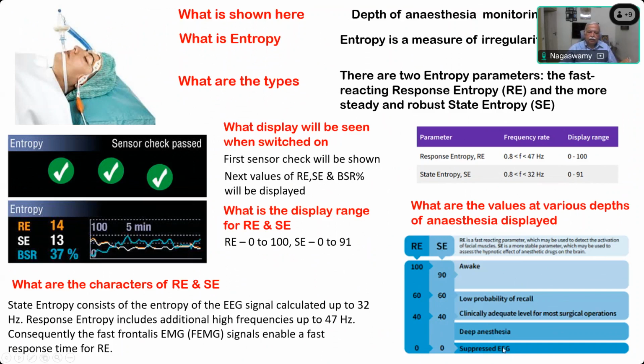So this can be used as a part of brainstem testing also. If you put this monitor and you get a value of 0, that means there is no electrical activity in the brain. So this can be used as a part of brainstem death confirmation also.